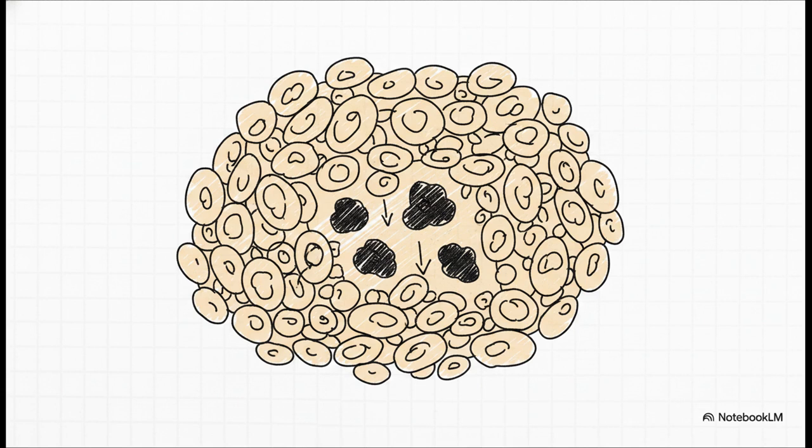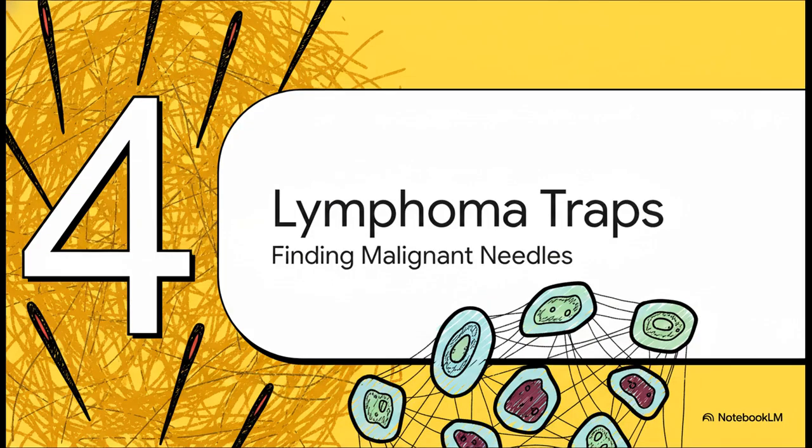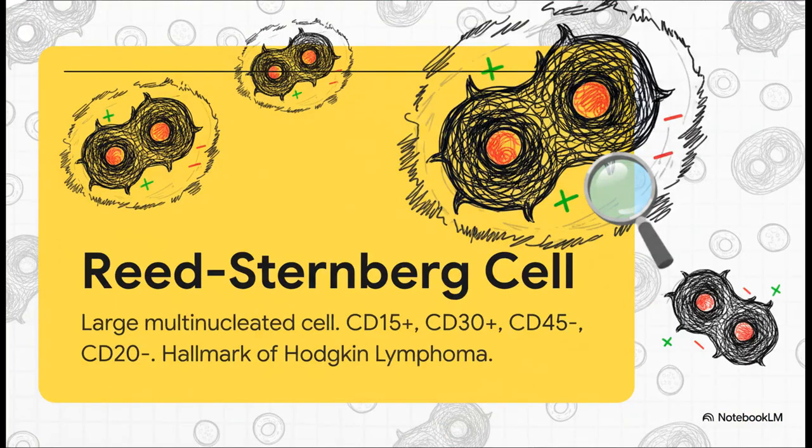Then you have Lennert lymphoma, which is a specific peripheral T-cell lymphoma characterized by abundant epithelioid cells. And, of course, T-cell/histiocyte-rich large B-cell lymphoma, where the actual malignant B cells make up less than 10% of the cellularity, getting completely drowned out by reactive histiocytes. Which brings us perfectly to Section 4, lymphoma, the diagnostic traps. We've talked about the mimics, but now let's focus on finding those malignant needles in the reactive haystacks.